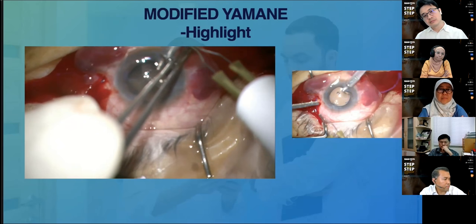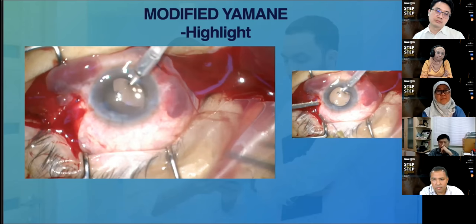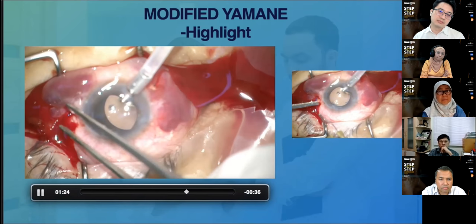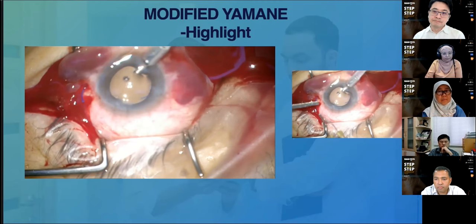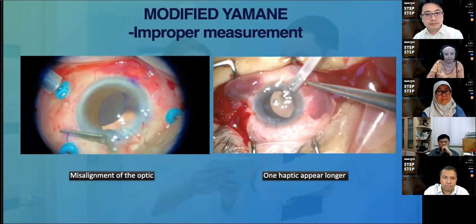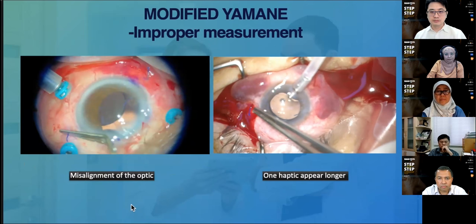So one of the reasons for what happened in this particular case is that because the first haptic was fixed at the beginning of the surgery, there was very limited space for the surgeon to maneuver the second haptic and to externalize it safely. So probably that was what happened in this particular case. And this is just to highlight the importance of proper measurement, or else you might end up with a slightly misaligned optic, as in this case.